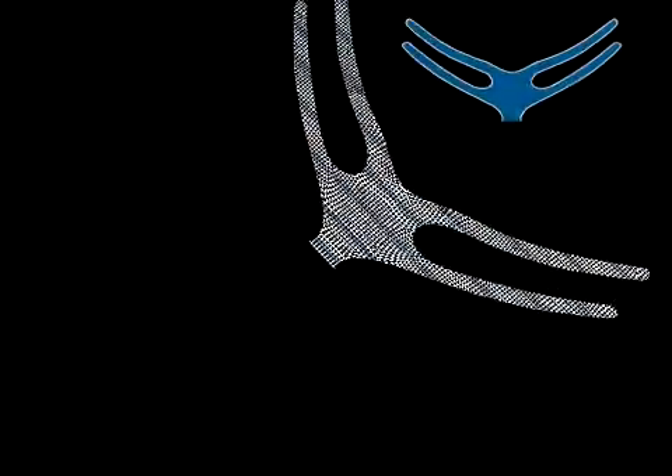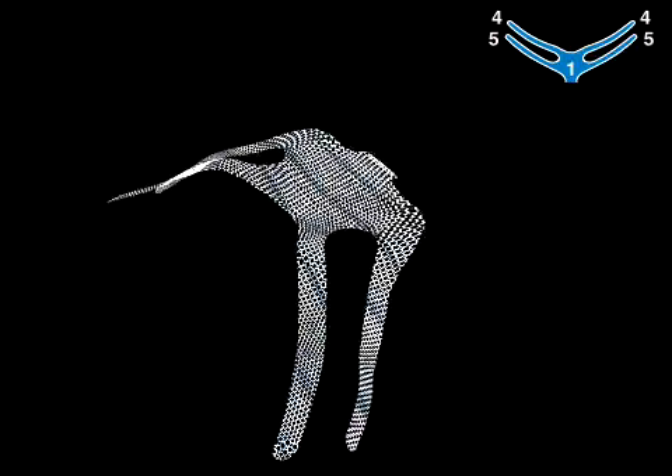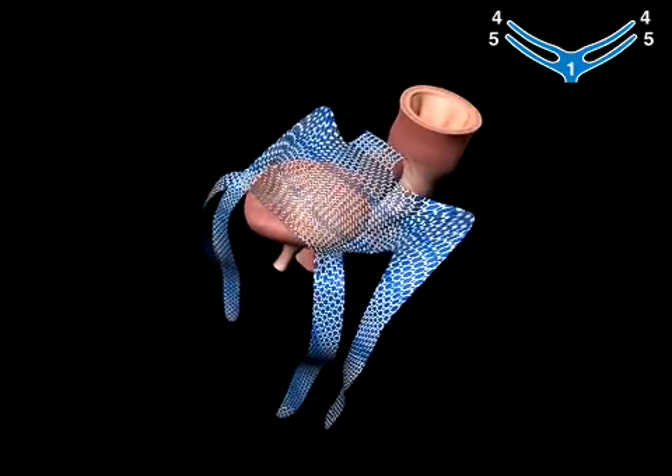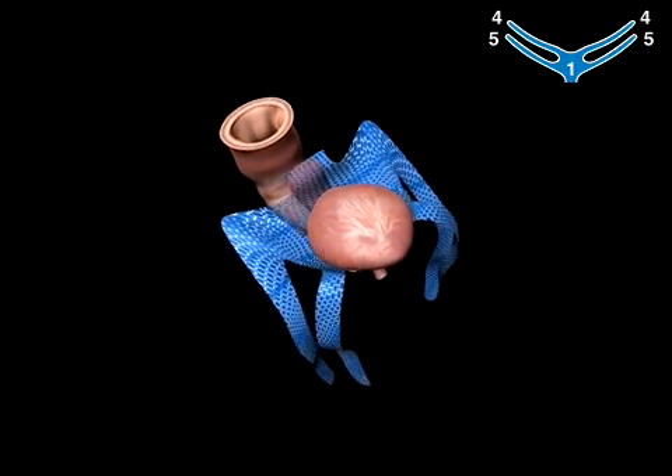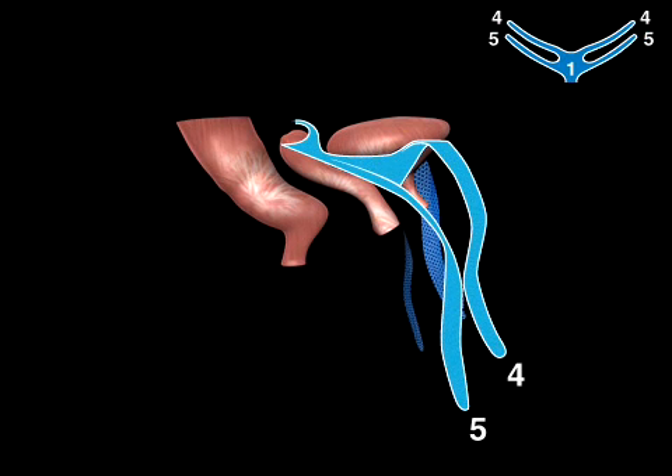Gynecare GynaMesh PS is a soft, pliable polypropylene material intended to reinforce weakened visceral connective tissues that surround the vaginal epithelium in the patient with pelvic floor prolapse. The mesh is pre-cut to form a supporting core implant with attachment arms.